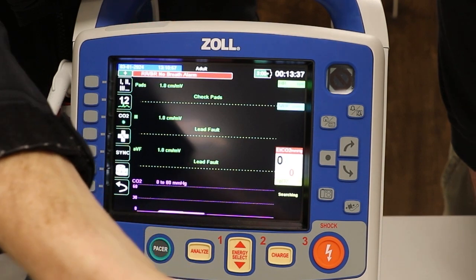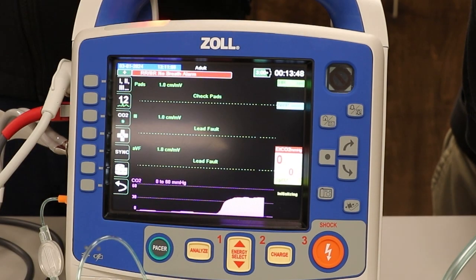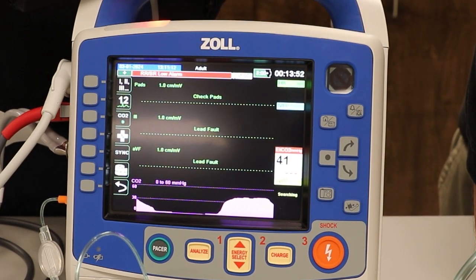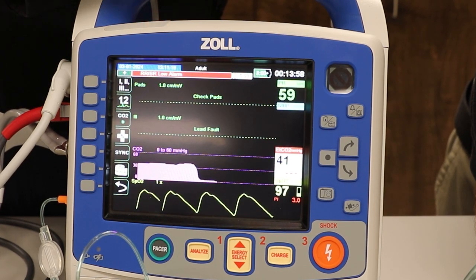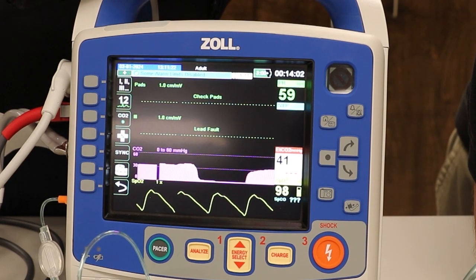I'm going to put a pulse ox probe on David's finger. What I want you to see is, again, we talked about this pulse ox. We talked about it can be a misleading number. It's reading oxygen on that arterial blood. That's what it's reading. It doesn't mean it's reading the respiratory effort. Capnography is going to give you exactly what's going on as far as their actual respiratory effort.